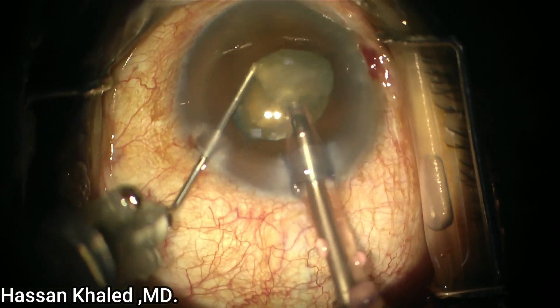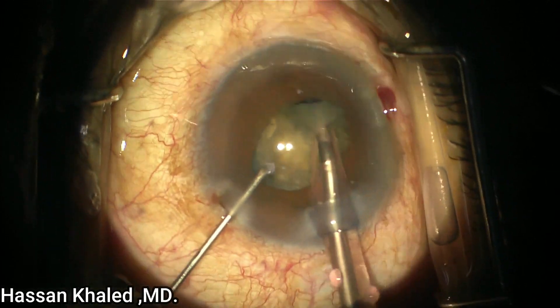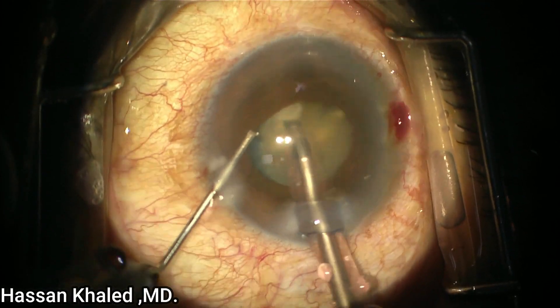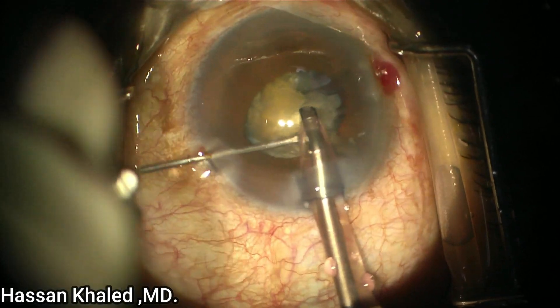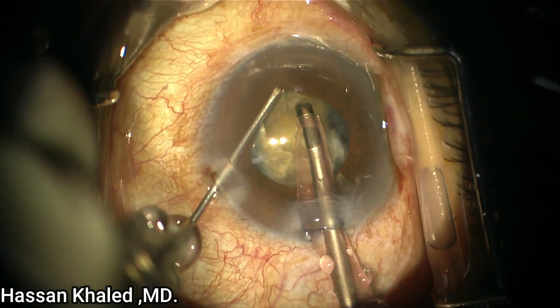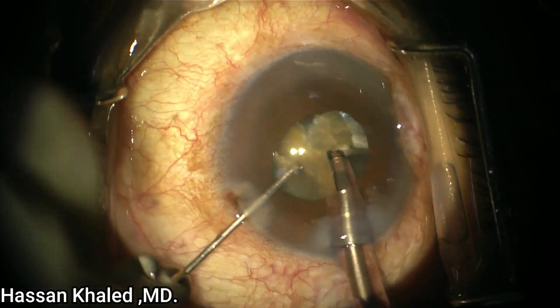Now I hold this piece and emulsify it at the level of the pupil. You can see the pupil starts to constrict and you can see the cataract is very dense. I hold and chop, and caution should be taken to avoid damage of the posterior capsule by the sharpness of the needle tip.